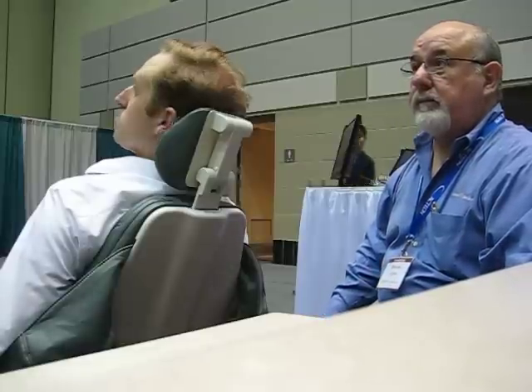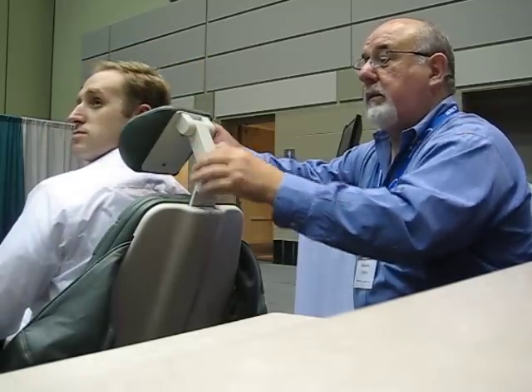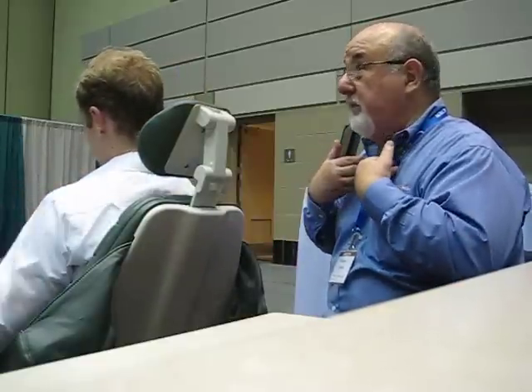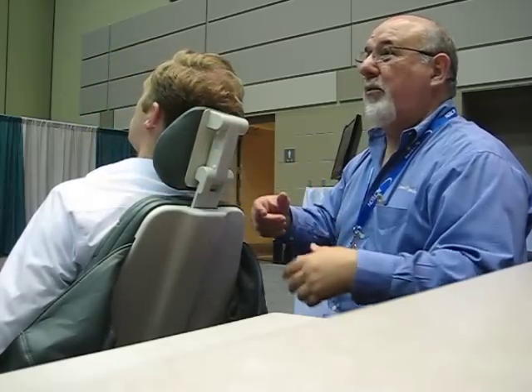I don't know, I still have a hard time. Does the chair have an option for an articulated, double articulated headrest? This isn't double. Lean forward, please. Oh, I couldn't see. I thought it was fixed. I'm just saying, if he had a Dowager's hump, then I would use the articulation. That's my technique that I teach doctors, and of course it's one less thing for them to worry about. Now Rick Coppins was in here and he said, no, I prefer the articulation like this, and you were the patient, I believe. And he goes, isn't that more comfortable? He goes, no, it's less comfortable.